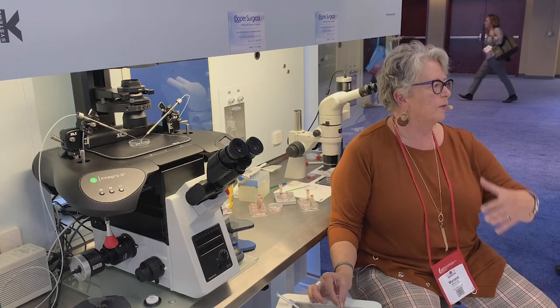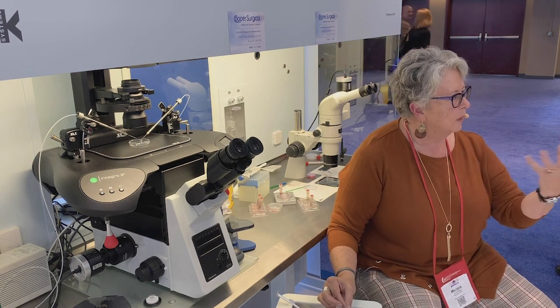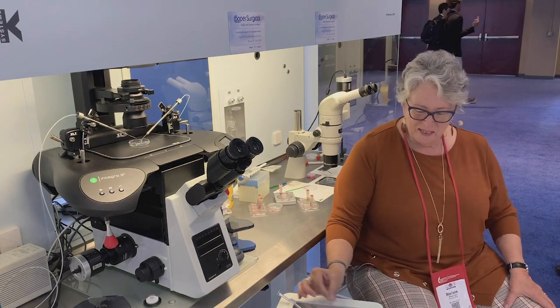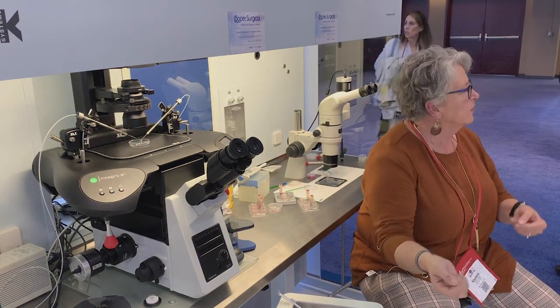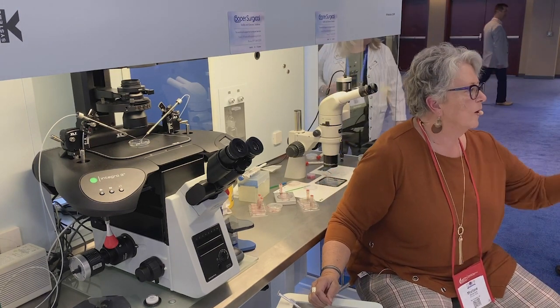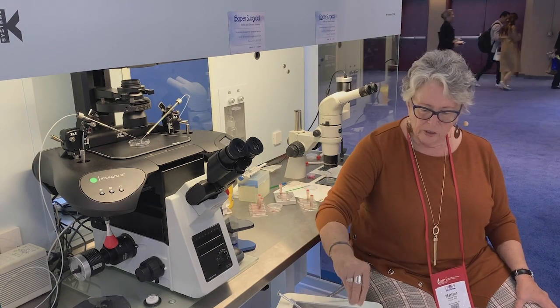You want to get it cold fast, so you don't want to just let it sit there, because it's going to have that little vapor bubble around it. So you want to move it around, but don't shake the hell out of it. Be nice to it. So you put it in, you move it, and then while it's still under liquid nitrogen, slide your cover over. The primary rule is, once it goes into the liquid nitrogen, you never, never, never, never, never take it out, right? Okay.